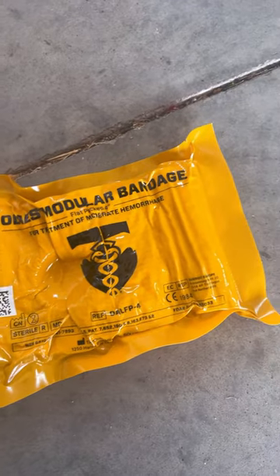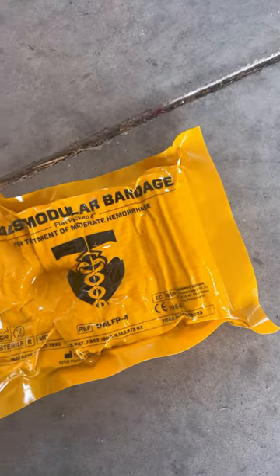All right, let's take a look at the OLAES four-inch bandage. This is going to be the four-inch flat.